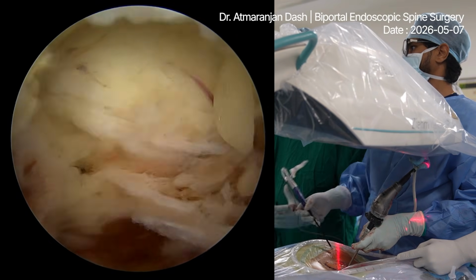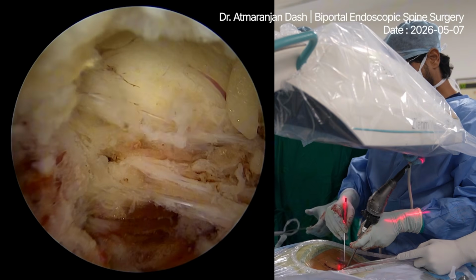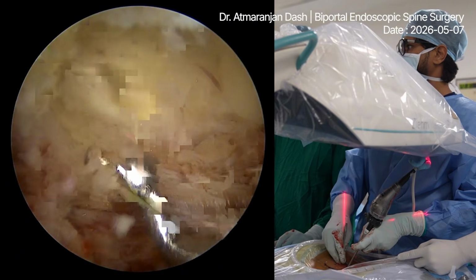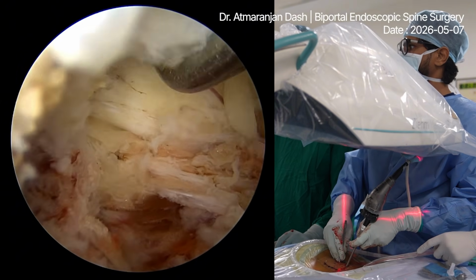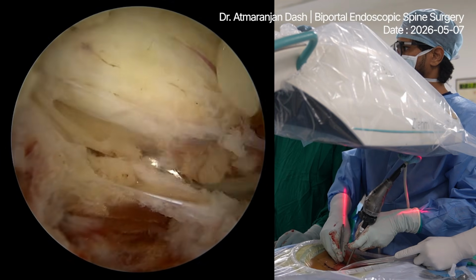Stop. Hook, please. So in this area you have to be gentle around the, so this looks like it could be the root. Okay.